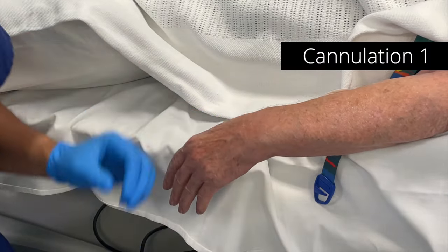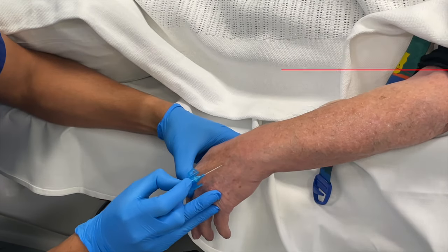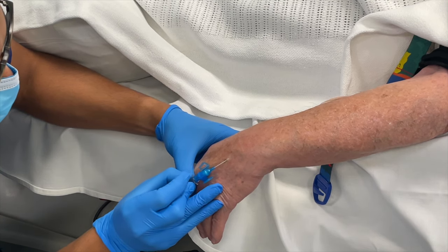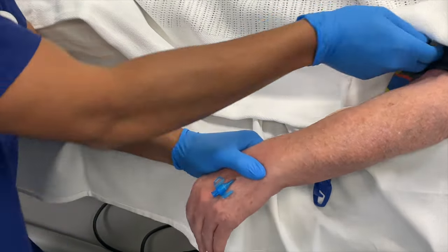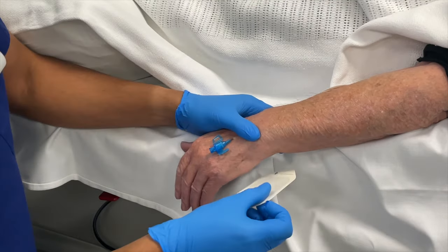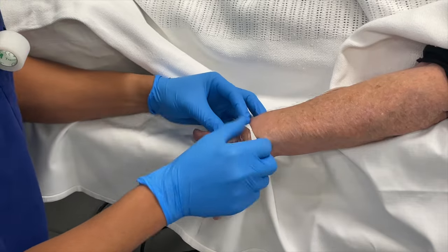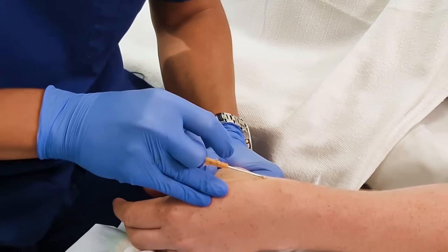For this video, as we're watching these cannulations, I thought I'd do a bit of commentary. This is my first cannula of the day, and I'm using one of these fancy cannulas — a really great cannula that doesn't need an IV bung to cap on the end, so there are fewer parts to use. I'm so used to a normal cannula that I instinctively put my thumb over proximally to stop backflow, but that's not really possible with this one. As I advance the cannula there's a bit of tethering in the skin — it's probably up against a valve — so I pulled it back just a millimeter, which meant I could flush it easily.